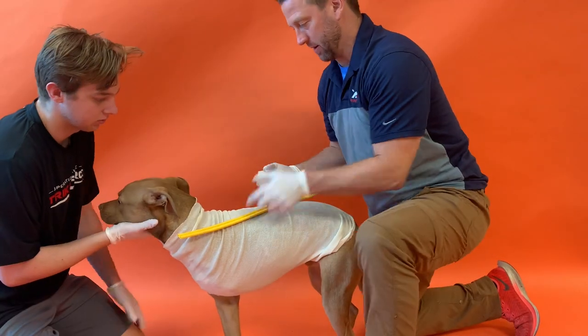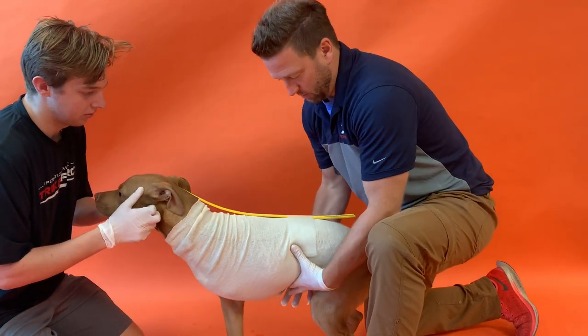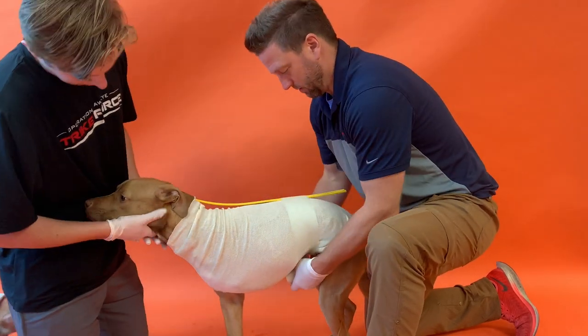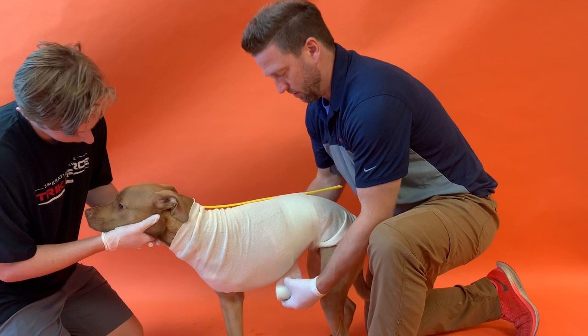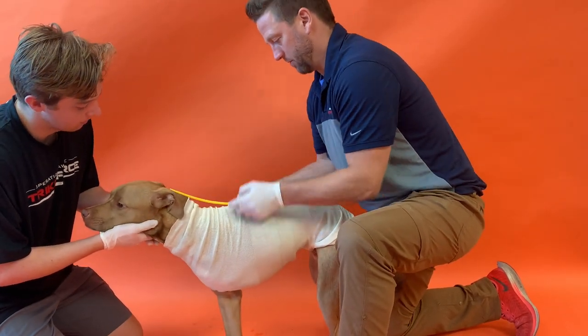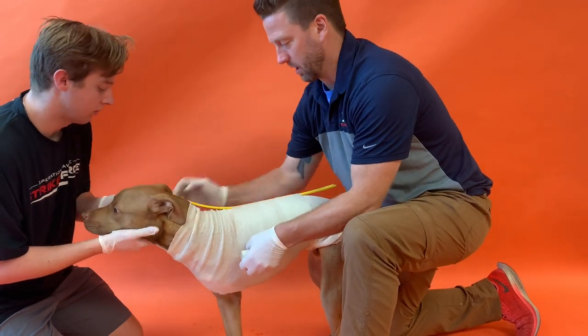The more you cast the better — get at least to the end of the ribs, but I like to go around the abdomen as well. Start down here and just keep rolling.